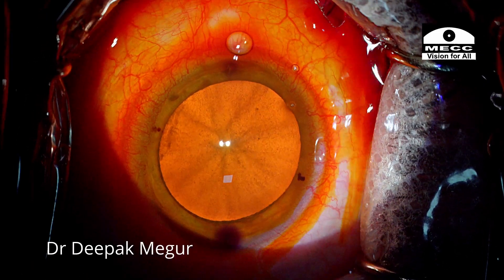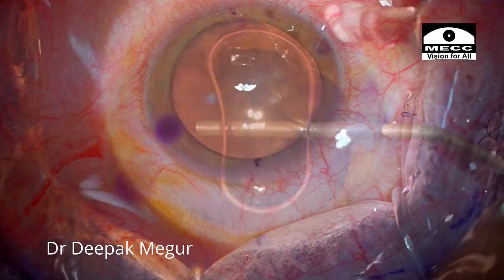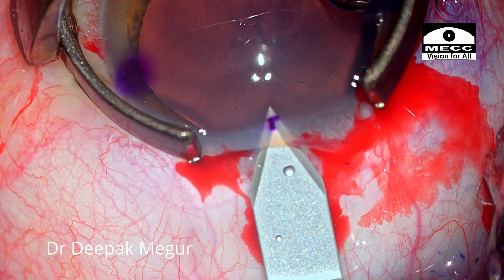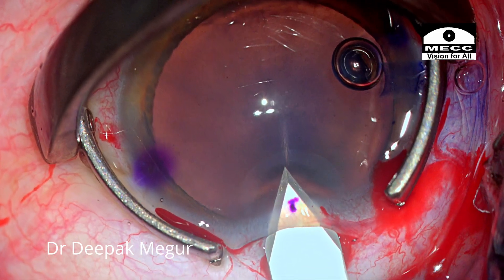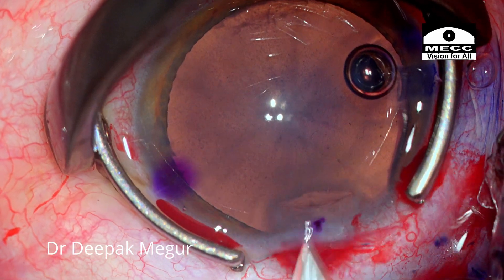Temporal incisions for phaco are my routine, but in this case I am shifting superiorly and placing my main incision of 2.8 mm centered around the 70-degree axis. By doing this I am hoping to induce some flattening on this meridian to reduce the amount of residual astigmatism.